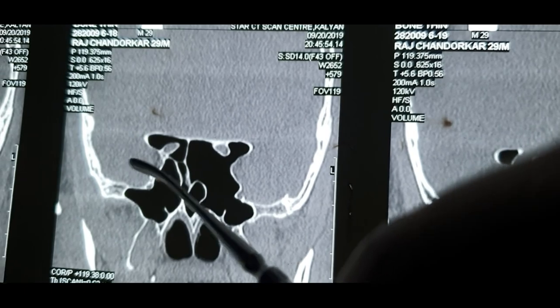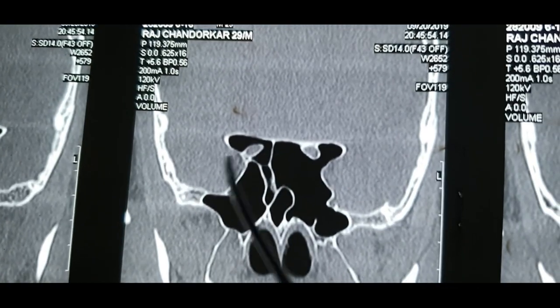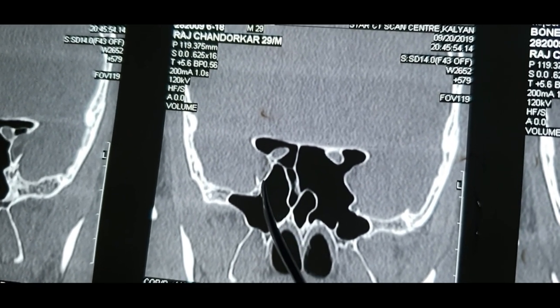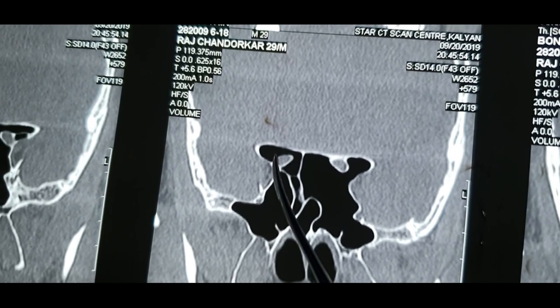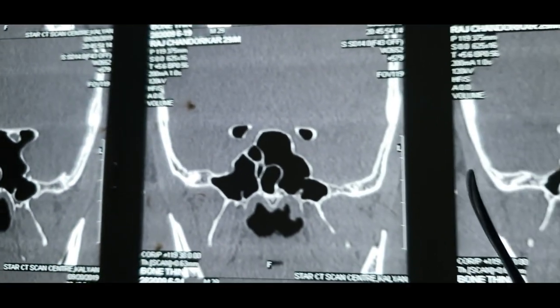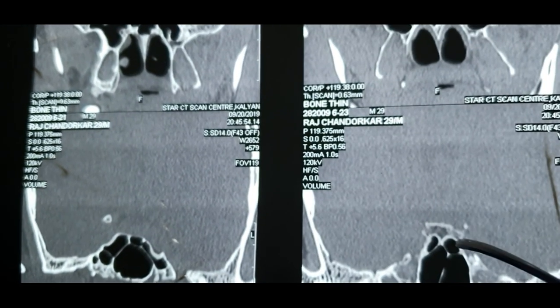Now, the area of the anterior clinoid process, exactly at this level, so this is the area of the anterior clinoid process. If you take this axis exactly below at the level, posteriorly if you go, you can see the posterior clinoid process. See this area? See this bulge? That's the posterior clinoid process. Not well pneumatized, but yeah, that's the area of the posterior clinoid process.